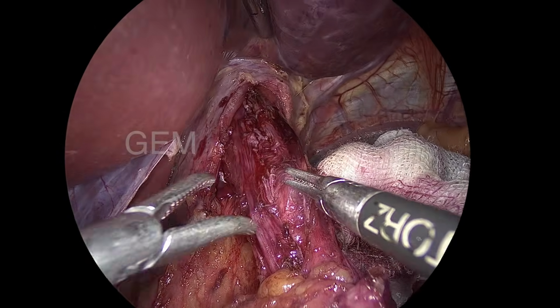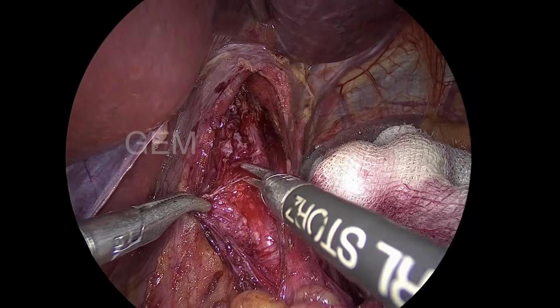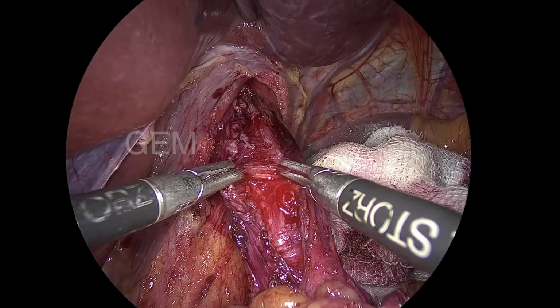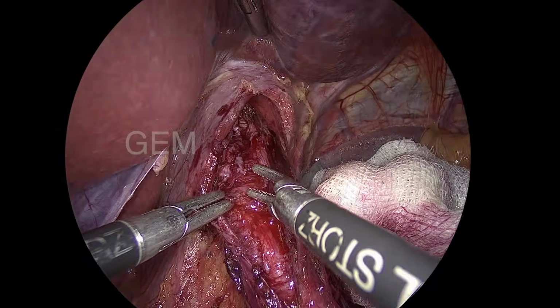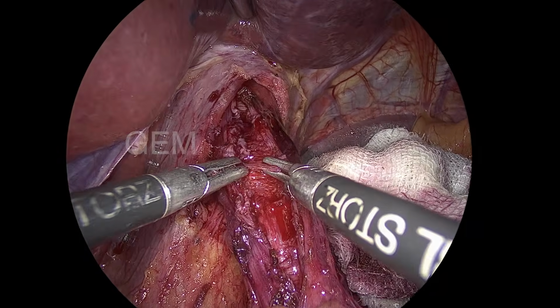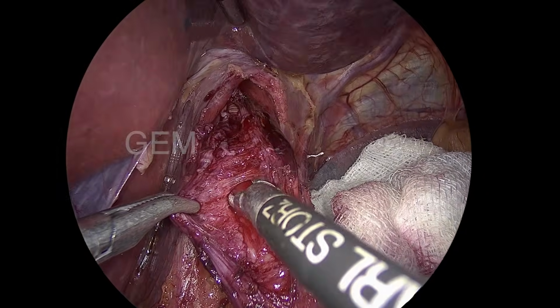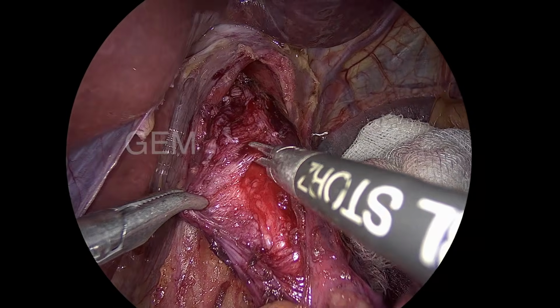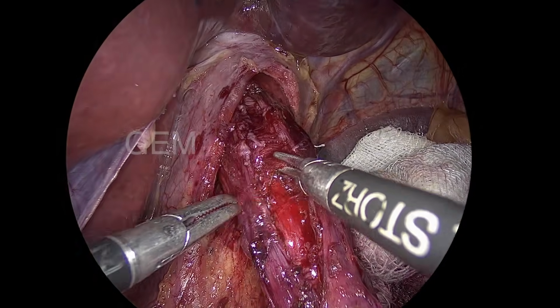So, you can see when I divide, I am not applying any cautery, I am just tearing the muscle, like this, because the blood supply to the circular muscle is very rare; only once in 3-4 centimeters a small vessel will come. So otherwise, just tearing like this is enough. Only the longitudinal muscle has a blood supply. So here, just tearing is enough; it is a very small vessel, so bleeding will not happen.